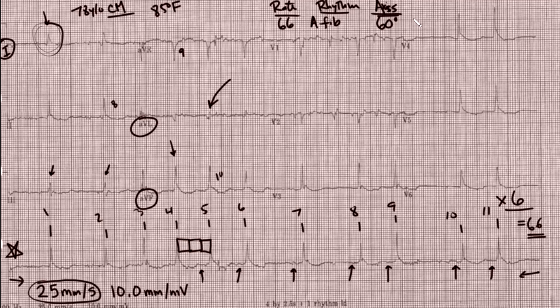We've got rate, rhythm, axis. Now are there any kind of funny ST segment changes? And the answer is yes. You can see here a kind of notching. There's several names for this notching. It's known as the J wave or even called an Osborne wave. The reason why it's called an Osborne wave is because it was discovered in 1953 by a guy named Osborne who was doing research in hypothermia.